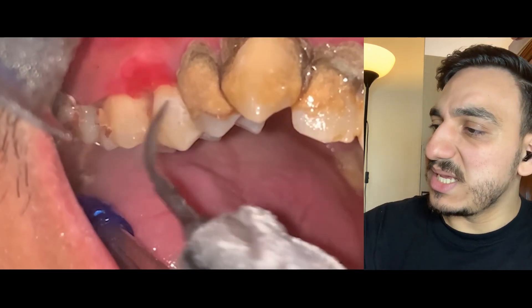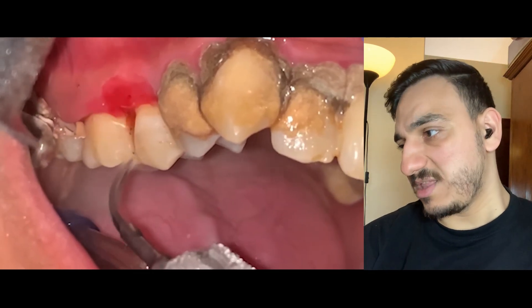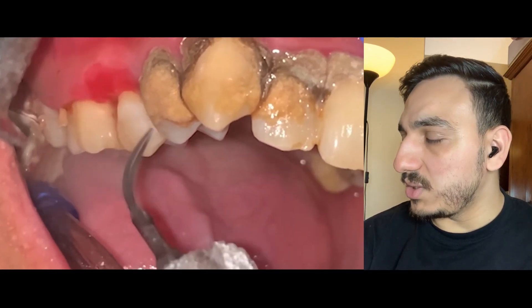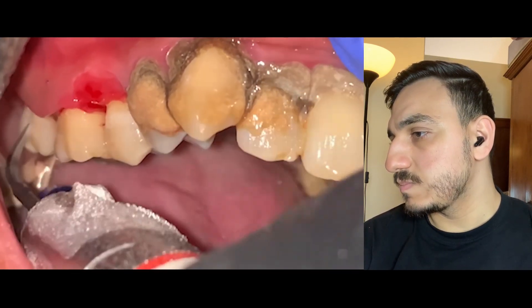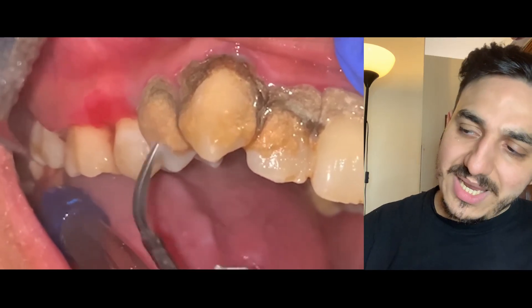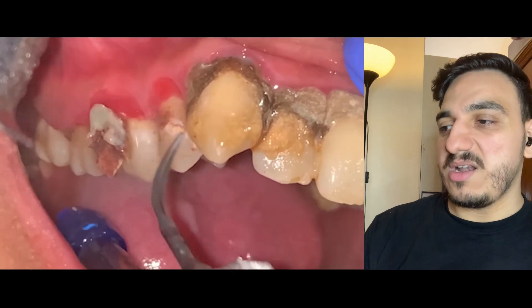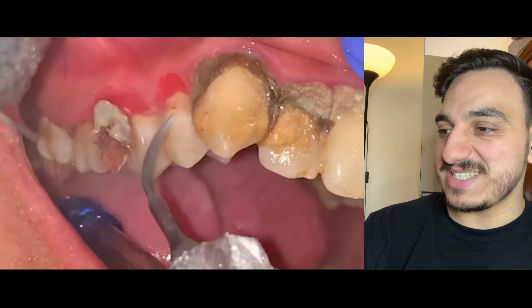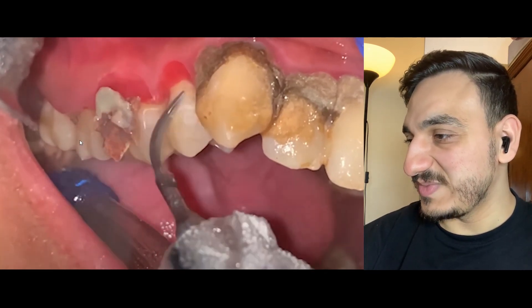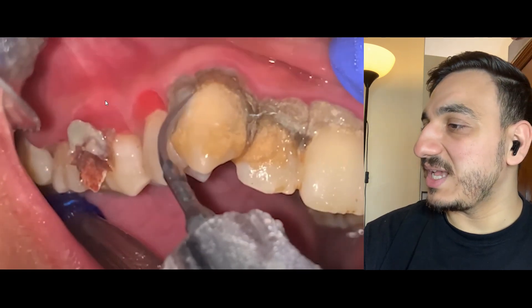The operator is removing the stains remaining on the pre-molars and molars in the back and will proceed into the canine and front teeth. The operator is trying their best to remove any remnant plaque, and look at how that whole chunk just pops off the tooth! Someone removes it with a tweezer. It's still there — somebody needs to take it off with the tweezers. They don't want to interrupt the operator as they're getting into it, and now we're getting to the front teeth.